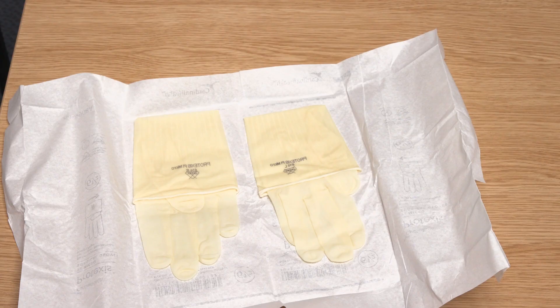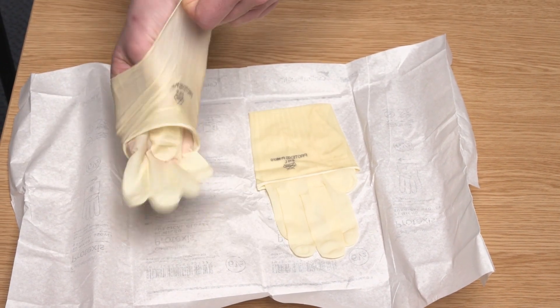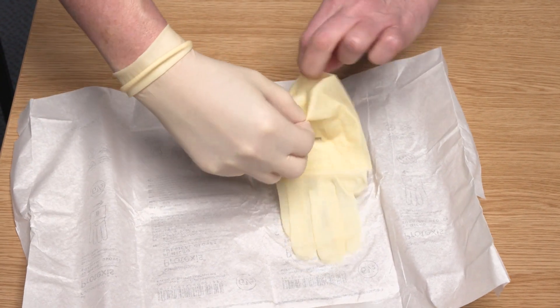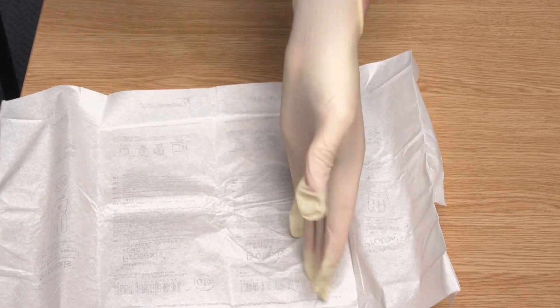For this part of the procedure I need to use sterile gloves as suitable PPE. I have opened out the sterile glove packaging using an aseptic non-touch technique, again being careful to only touch the outside of the packaging while doing this. I need to pick up the edges of the gloves and ease them onto my hands, doing one hand first and then the other. You should not touch the outer surface of the gloves with your hands when you are putting the gloves on.